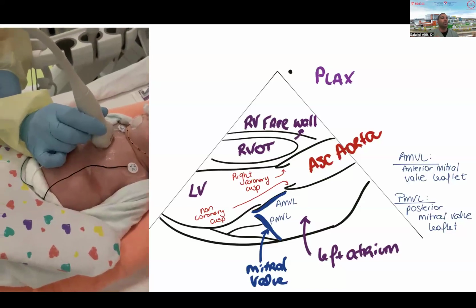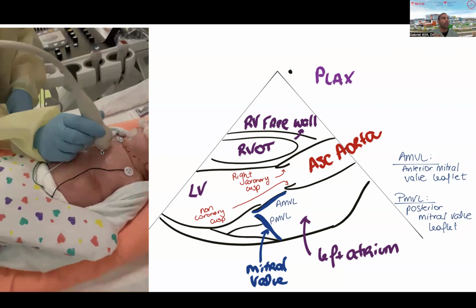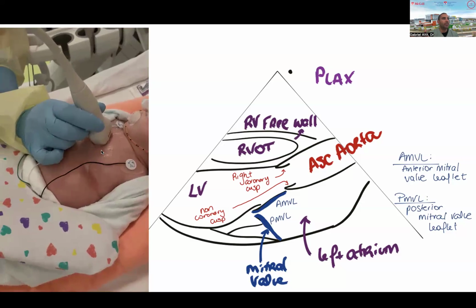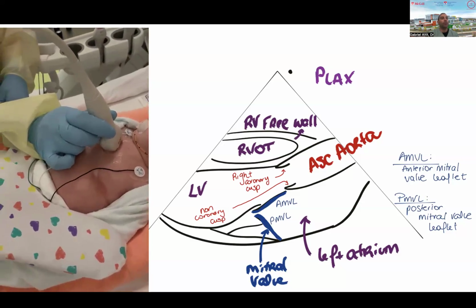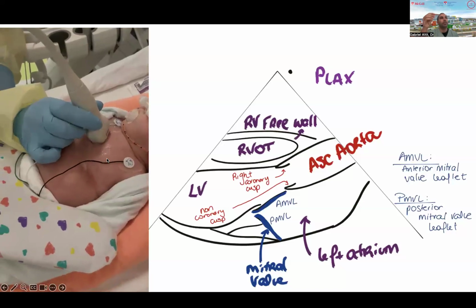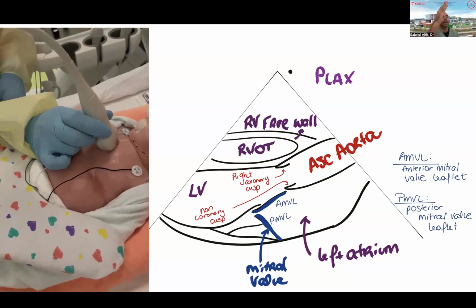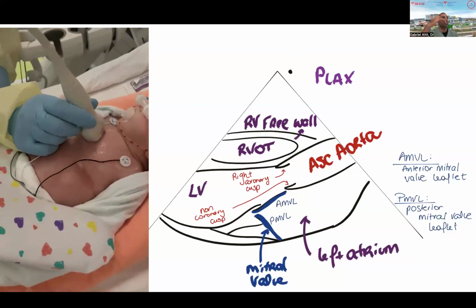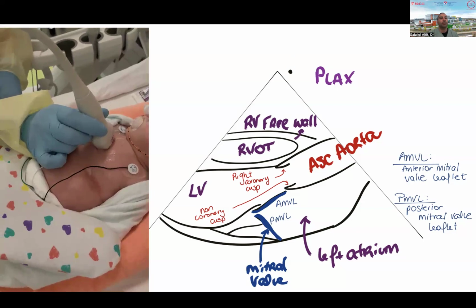So it's typically around the parasternal zone, around the third intercostal space. It's actually a bit of a lie; it's actually a bit higher in most babies. And then you need to orient yourself almost perpendicular to the chest, although sometimes you do have to tilt a bit with the tail of the probe a bit closer to the chin of the baby. So angulate a bit more posteriorly to cut more posteriorly.